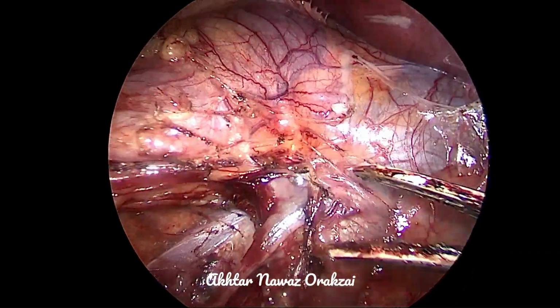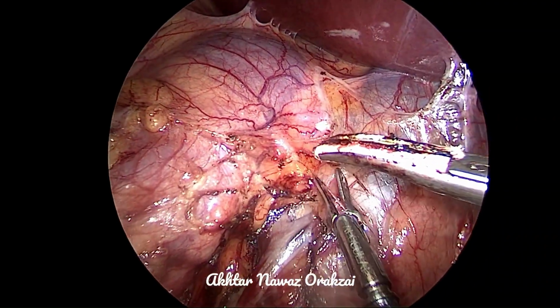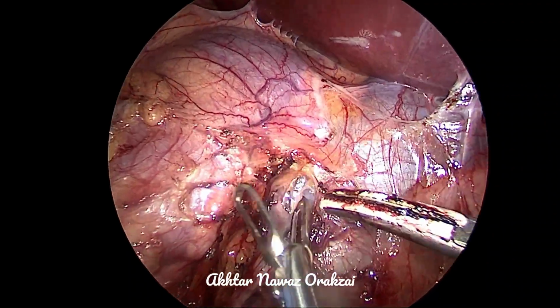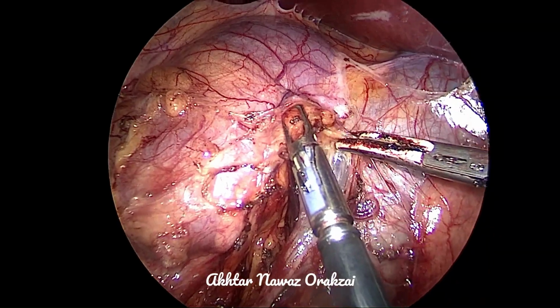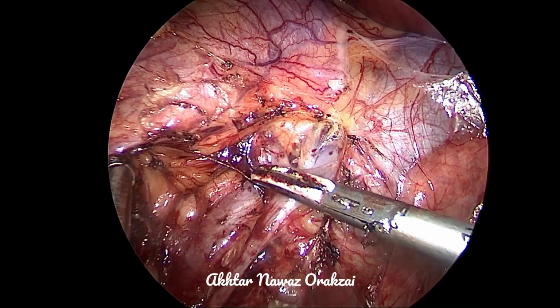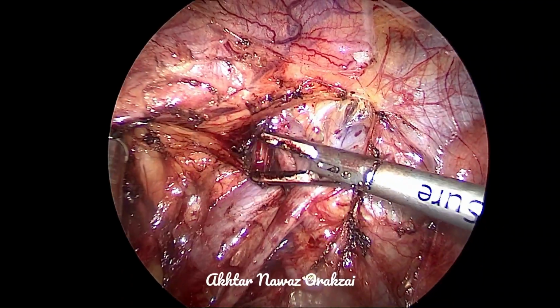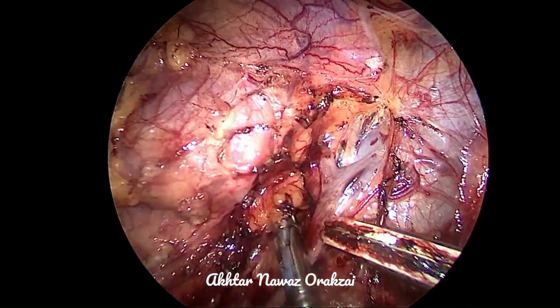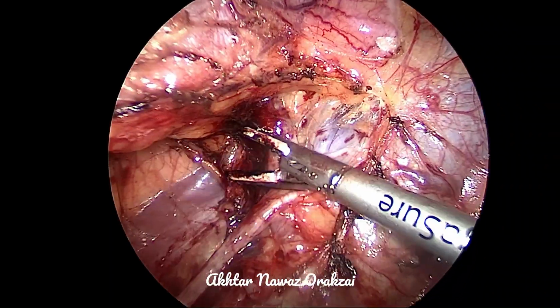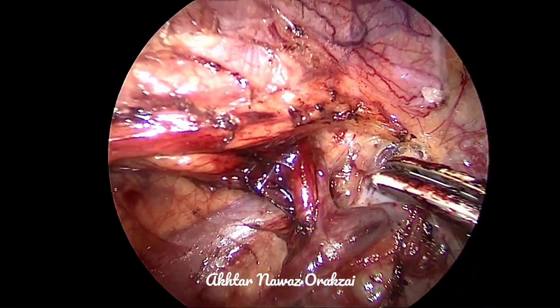crossing anterior to the IVC, and you can see that this artery is accompanied by a draining vein, and this vein is draining into the gonadal vein, and in turn the gonadal vein is draining into the IVC. So the situation has got a little bit difficult here, because a little bit of traction on the lower pole is providing a stretch on the gonadal vein because of the vein which is draining into it. So it's an interesting anatomy of the pedicle here.